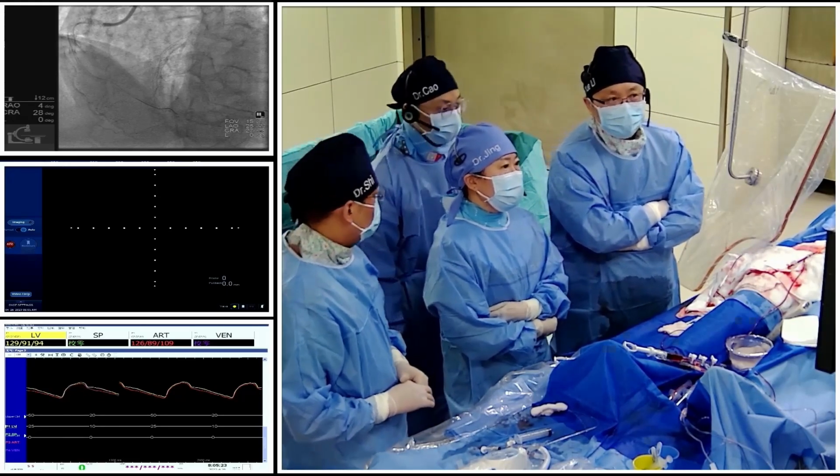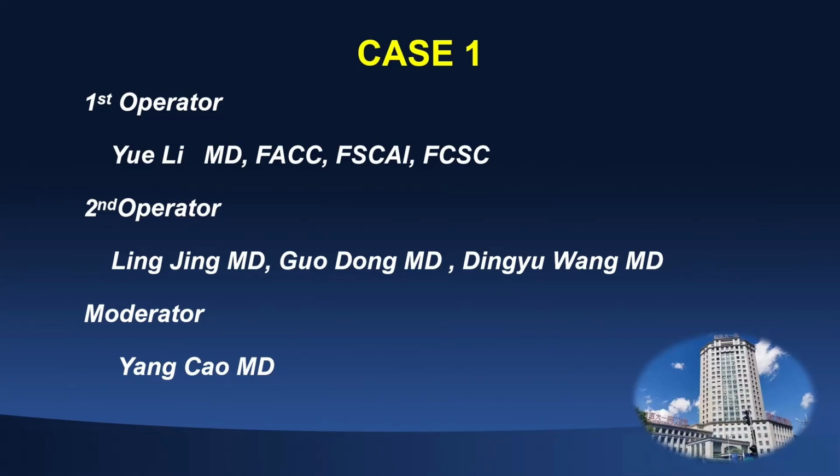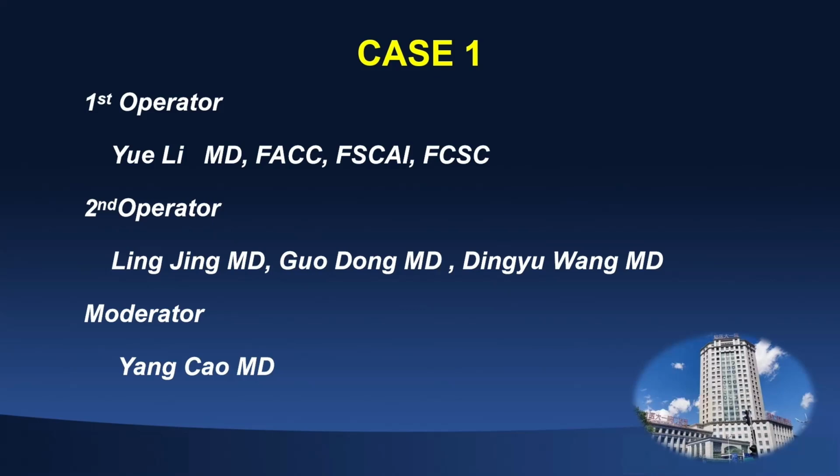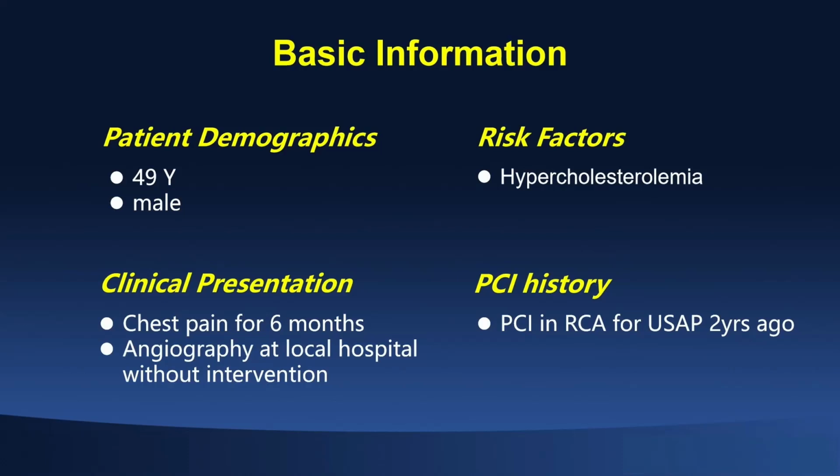Dr. Jing will introduce the general information of this case. Please, Dr. Jing. Okay, I'm very glad to introduce this case. Now, the first operator is Professor Li. The second operators are Dongguo, Wang Dingyu, and me. The moderator of today is Cao Yang.